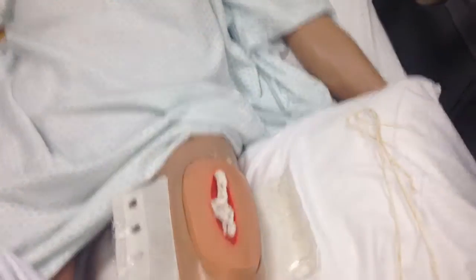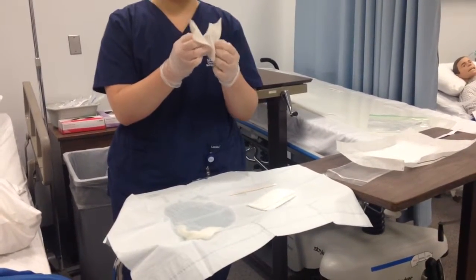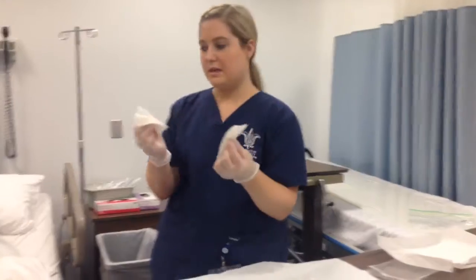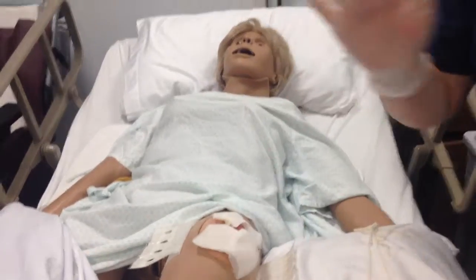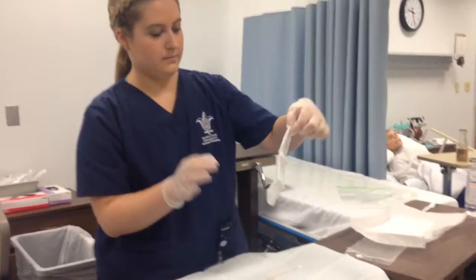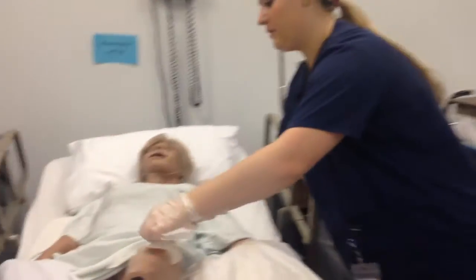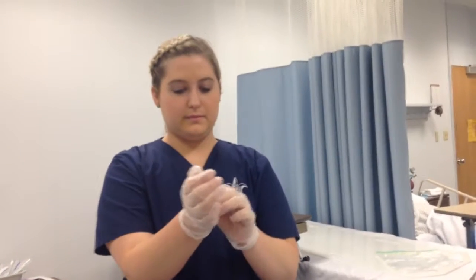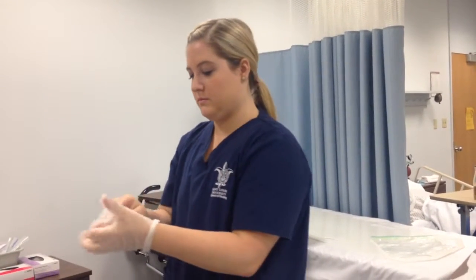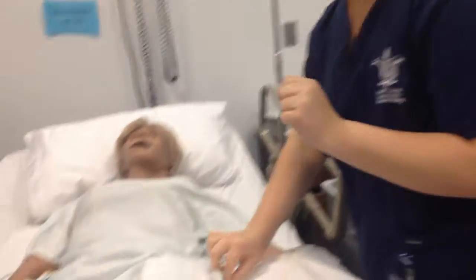Okay, so now I have packed my wound. And now I will take my dry 4x4s and split them in half. And I will place them on top of the wound. And then I will take my ABD pad, making sure to touch only the outside flaps. And then I will place this on top of the wound. And then I will remove my sterile gloves. And I will close the Montgomery strap on the wound.